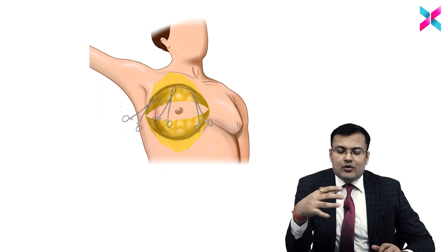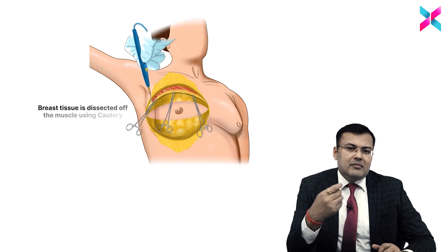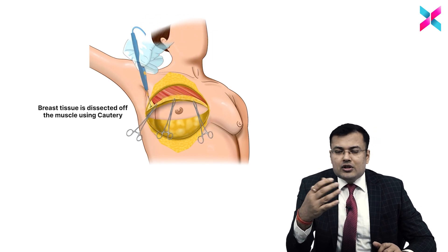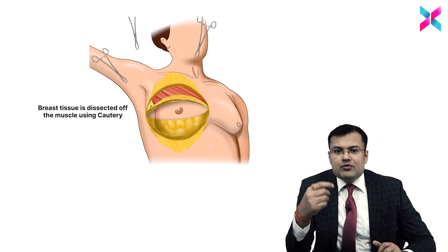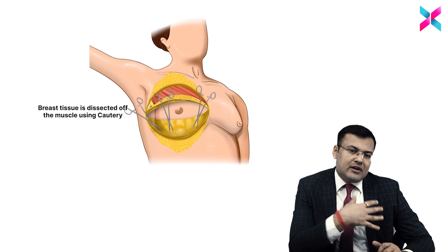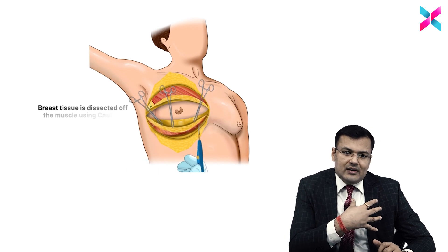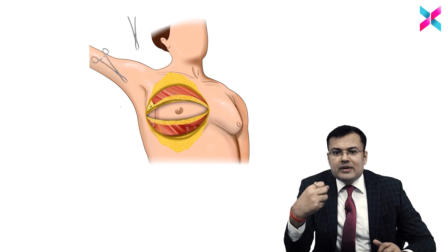After that, you can see which muscle is just behind the breast — pectoralis major. We are going to dissect off the breast tissue with the help of cautery from the underlying muscle. And after that, we are removing the whole breast tissue.